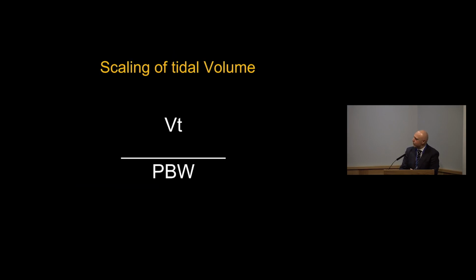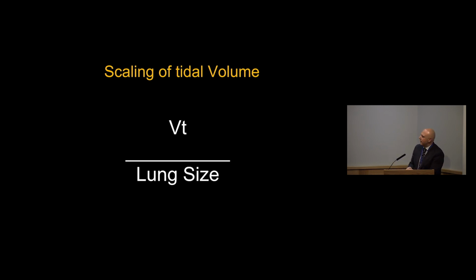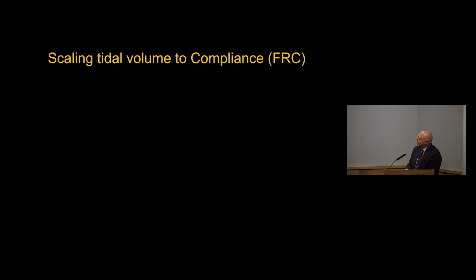So that's one for sure. When we try and scale the tidal volume to predicted body weight, that doesn't seem to work. So the much better question would be to scale the tidal volume to the lung size. But we have a problem, because to scale the tidal volume to lung size, we need to know the FRC.